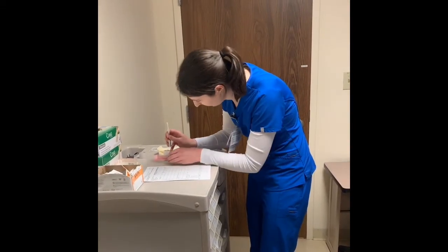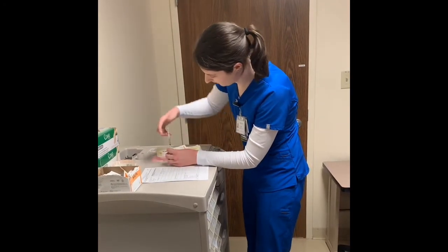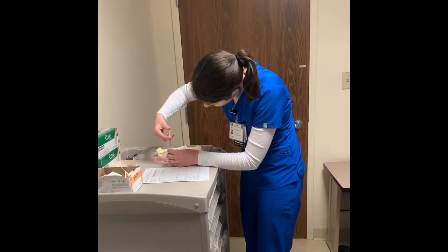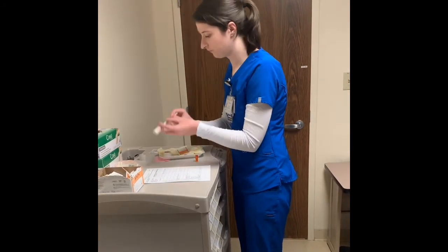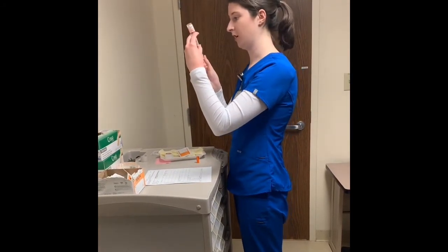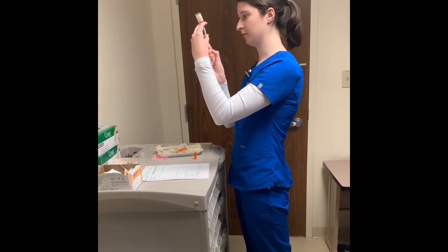I'm going to start by injecting the air into the vial. Now I'm going to withdraw 20 units of regular insulin from this vial.